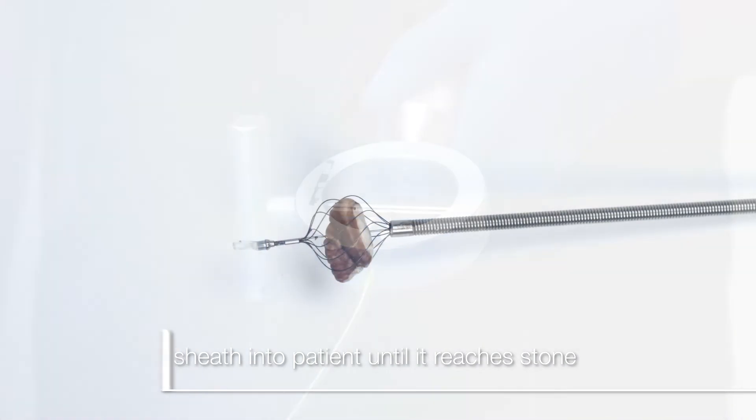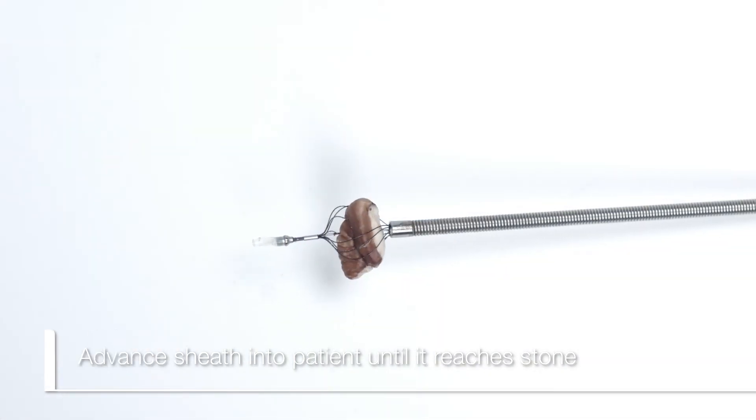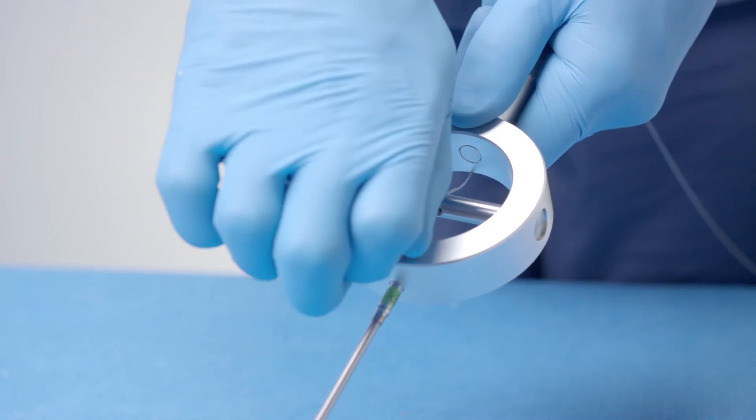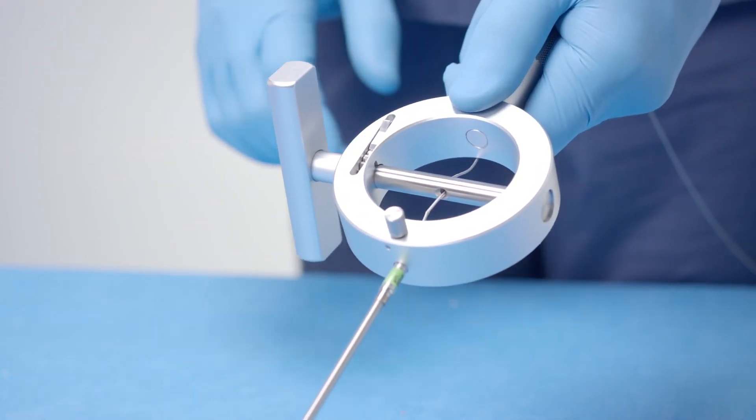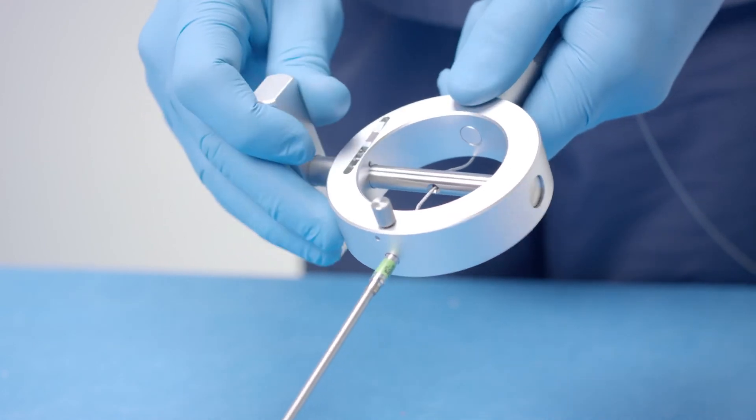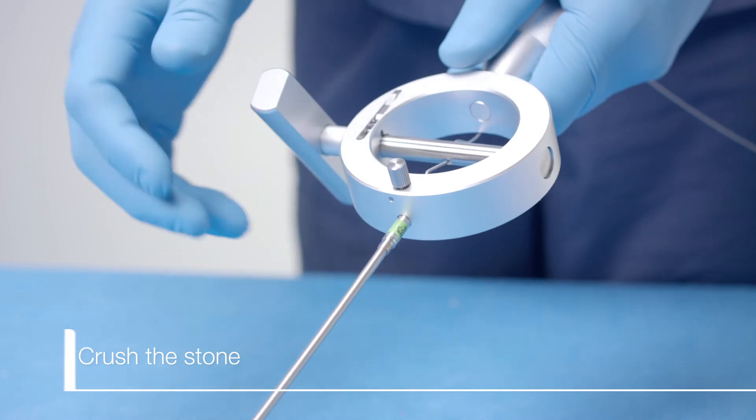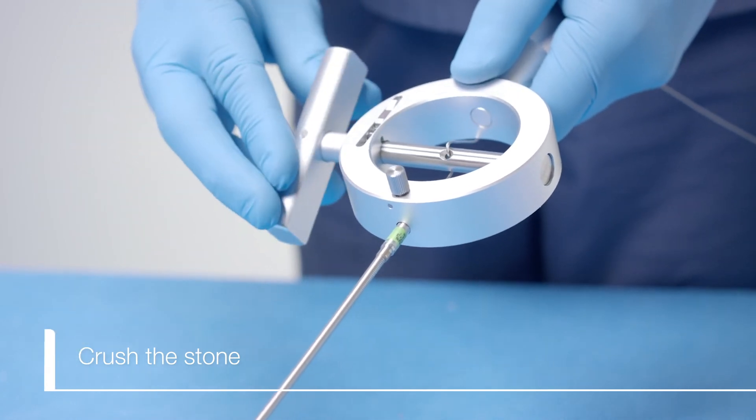Advance the sheath into the patient until it reaches the stone. Ensure that the ratchet is in the locked position and confirm the coil sheath is locked into the handle. While holding the basket wire against the handle with your left hand, slowly turn the rotatable bar with your right hand to crush the stone.